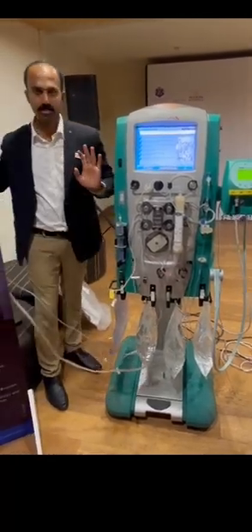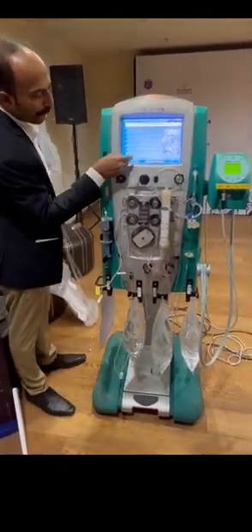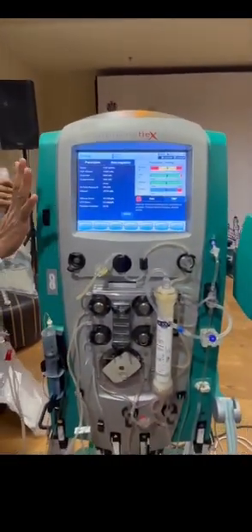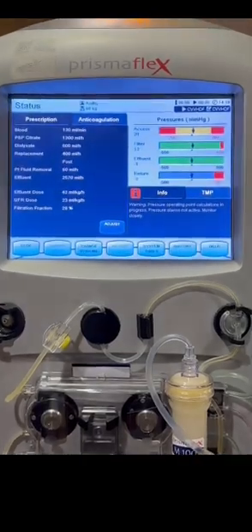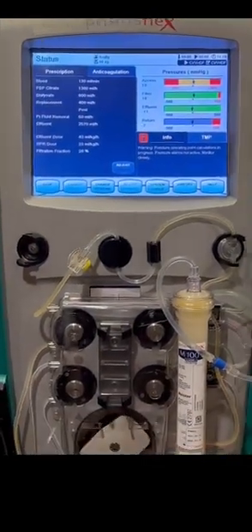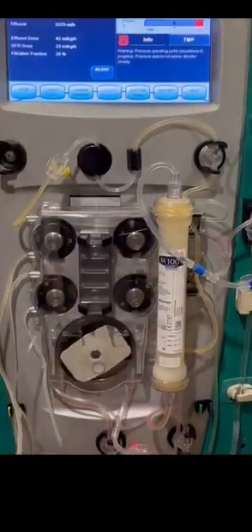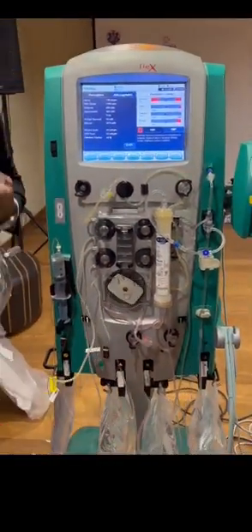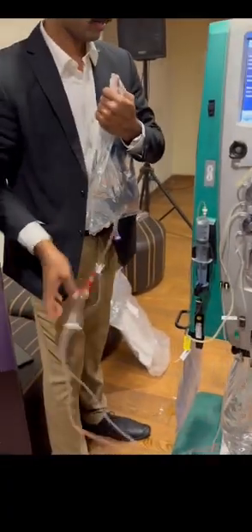So this is our patient. So I'm just starting. Continue. Start. Now the therapy starts. I will show you the lines, the alarms, the troubleshooting and the prescription. So this is clear, no? These two lines.